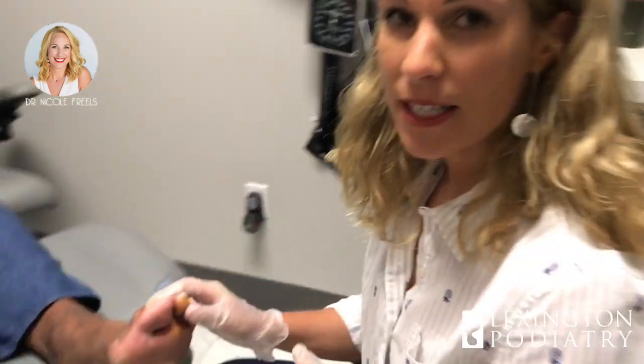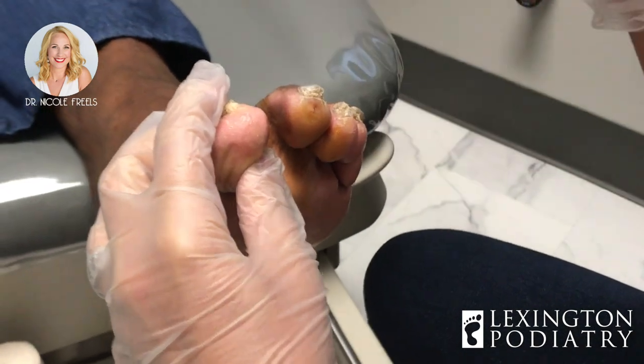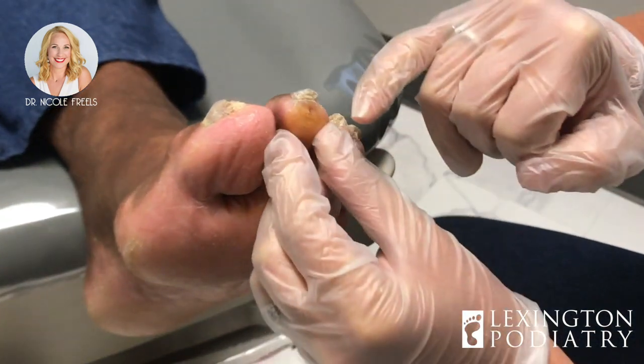Hey everybody, we are here today doing a simple tenotomy and capsulotomy, which is for a hammer toe that is at least semi-reducible or ideally reducible, meaning that we can straighten the toe out.